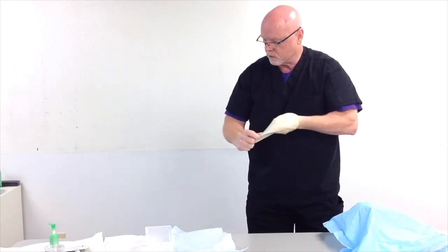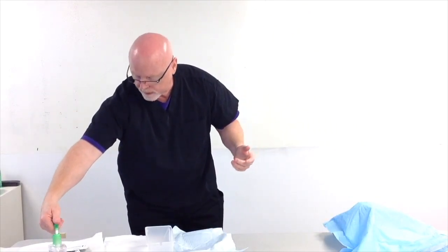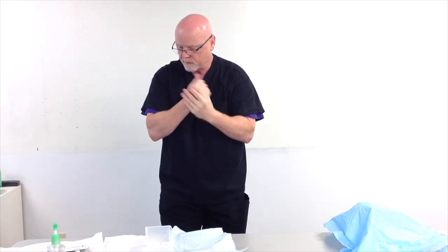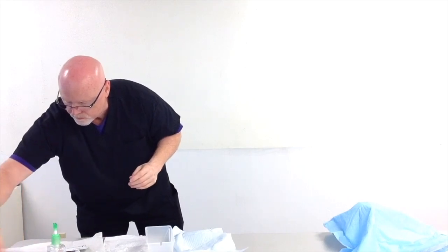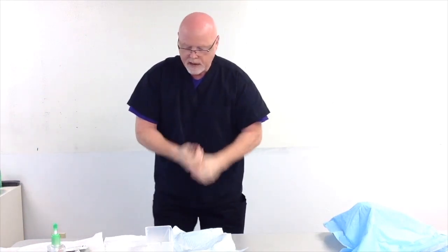You would remove your sterile gloves. What do I have to do every time I remove a pair of gloves? Gel your hands. And now I'm going to sit down and write my narrative notes.